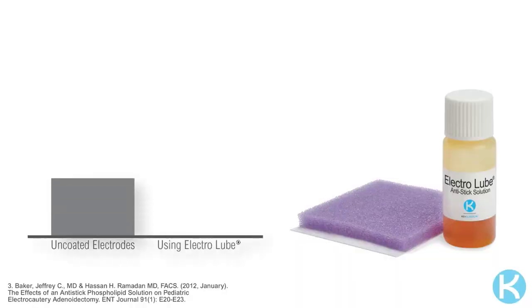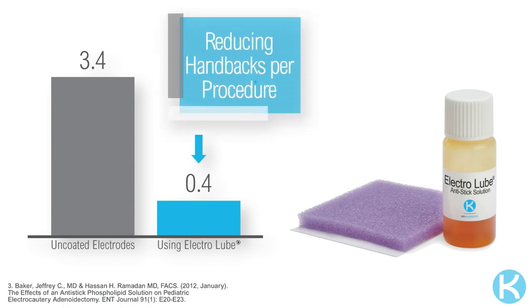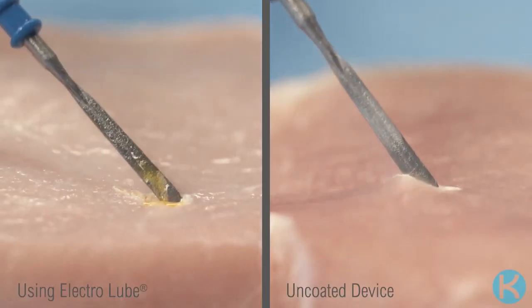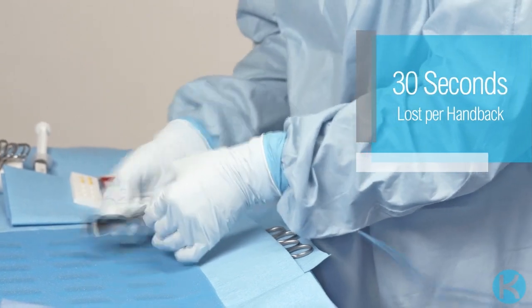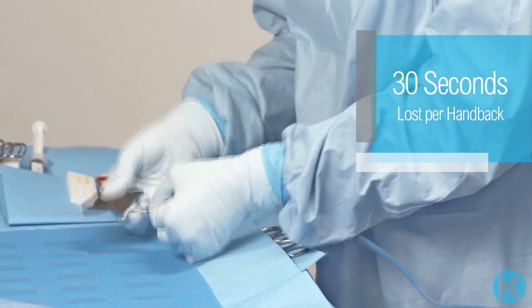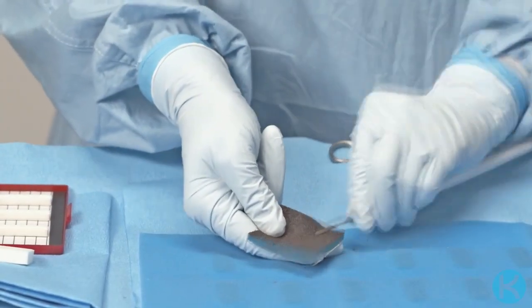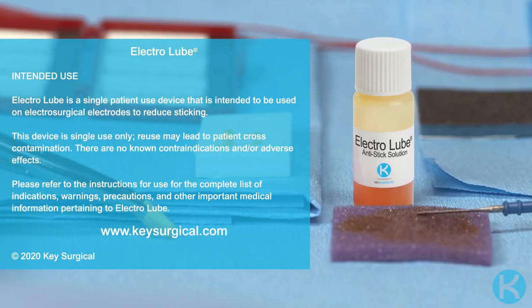A clinical study shows that the use of Electrolube significantly reduced the number of handbacks from 3.4 to 0.4 in a 30-minute procedure, compared to a procedure performed using an uncoated device. With an average of 30 seconds needed for each handback for cleaning the instrument, avoiding these procedural disruptions may lead to a meaningful benefit in terms of OR efficiency.